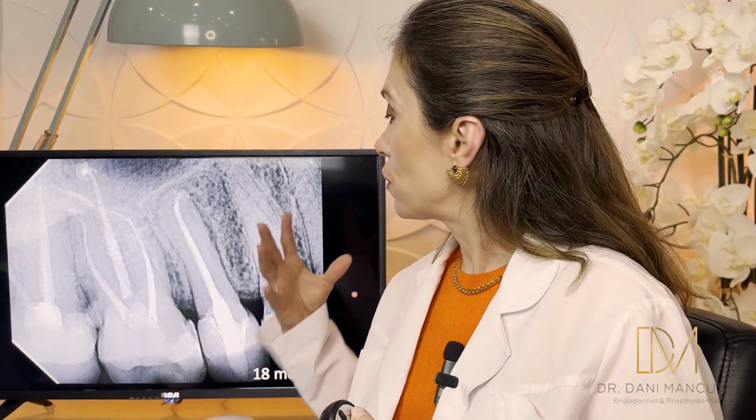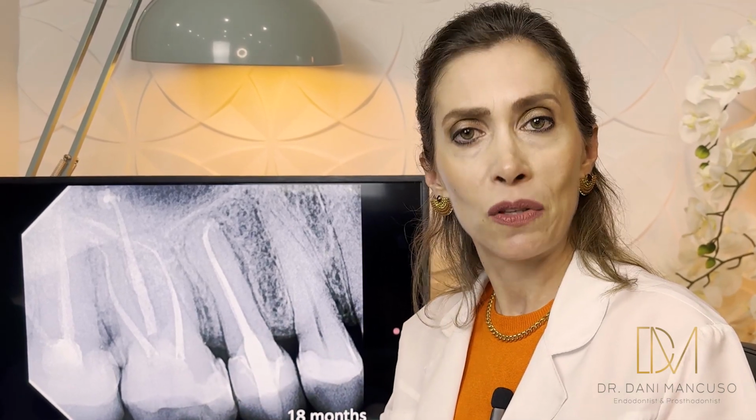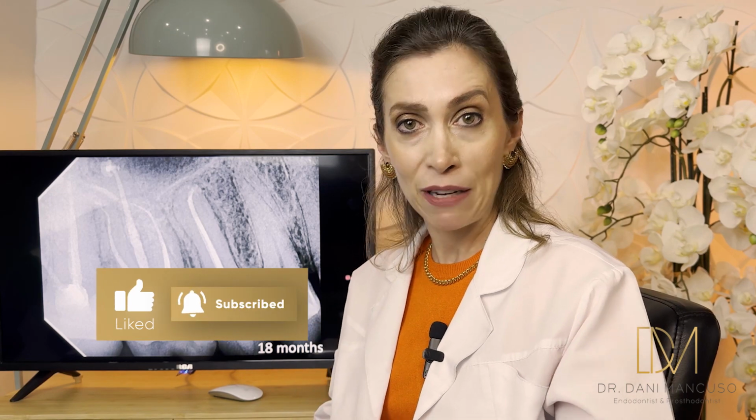I hope you have enjoyed this case, and I hope you look after those access cavities so you don't start enlarging them unnecessarily. Because if you enlarge them, you put the tooth at risk, mainly cervically, where is the weakest point of the tooth. So be careful with your access cavity. Don't forget to use magnification as well, otherwise it's quite difficult for you to see with those small access cavities.